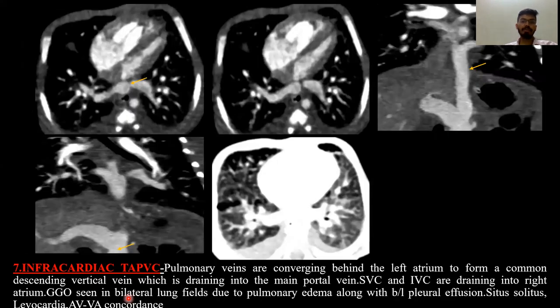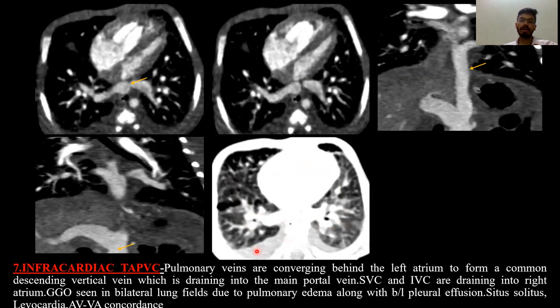The next case is infracardiac TAPVC. The pulmonary veins converge behind the left atrium, forming a common descending vertical vein which drains into the portal vein. The SVC and IVC are draining into the right atrium. Ground-glass opacities are seen in bilateral lung fields due to pulmonary edema, along with bilateral pleural effusion. The situs is solitus with levocardia and AV-VA concordance.